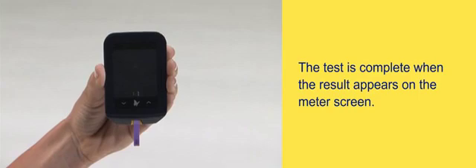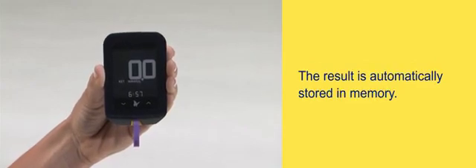The test is complete when the result appears on the meter screen. The result is automatically stored in memory.